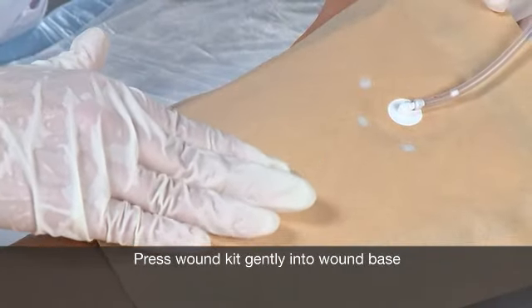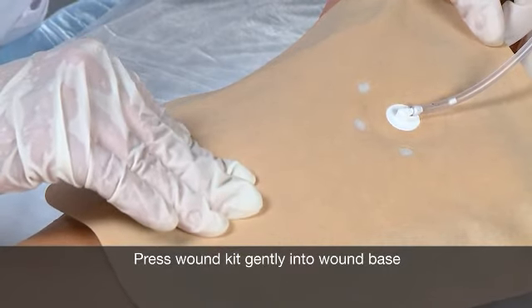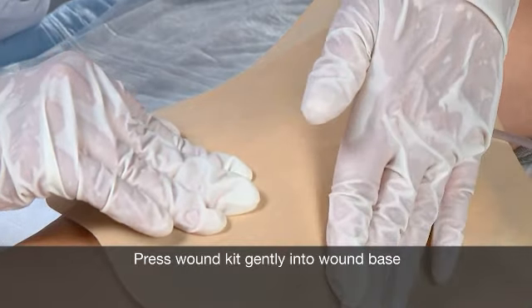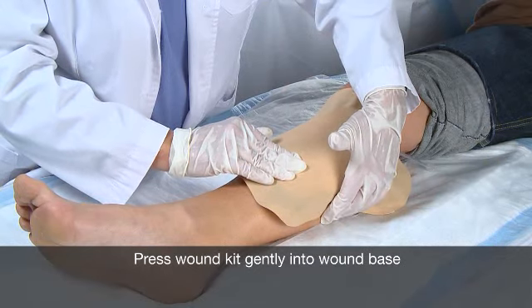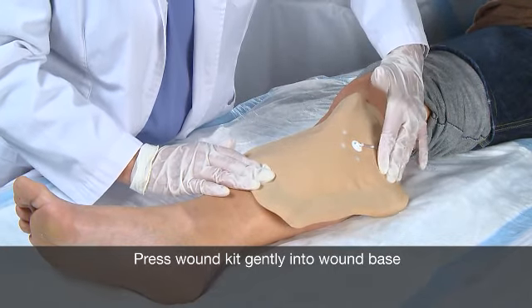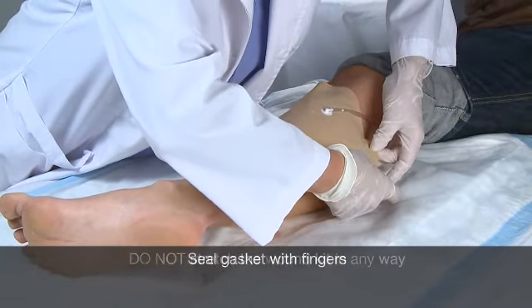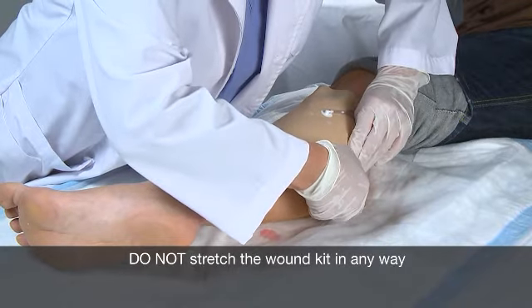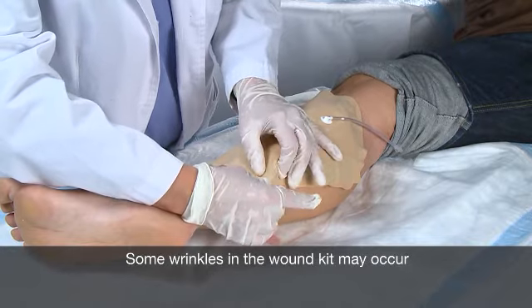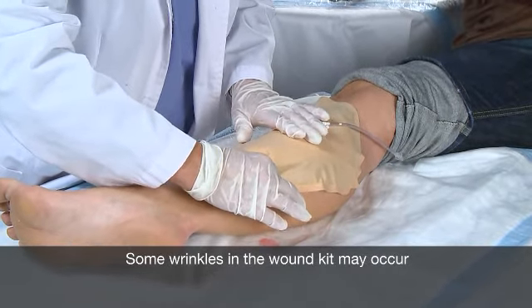Once placement is established, use a finger to place gentle pressure in the middle of the wound kit until the wound kit contact layer and wound base interface. This will provide enough slack in the wound kit to allow it to conform to the wound when negative pressure is applied without pulling on the para-wound area. Next, begin sealing the gasket by gently pressing on the gasket with your fingertips. Care should be taken to not stretch the wound kit. Try to minimize wrinkles during this process, but it is much better to have some wrinkles than to stretch the wound kit, as this could produce unintended skin trauma to the para-wound skin.